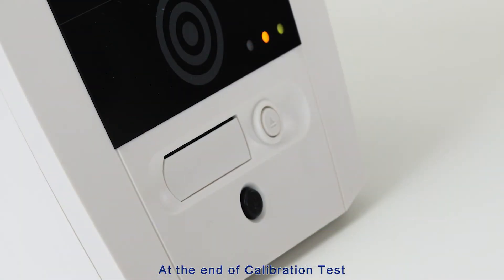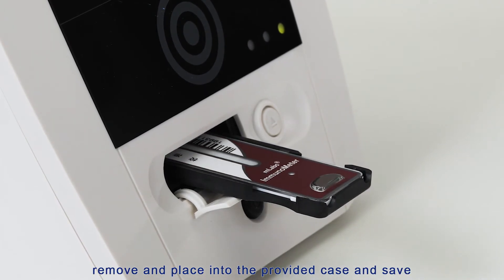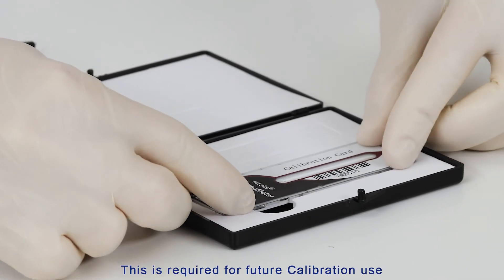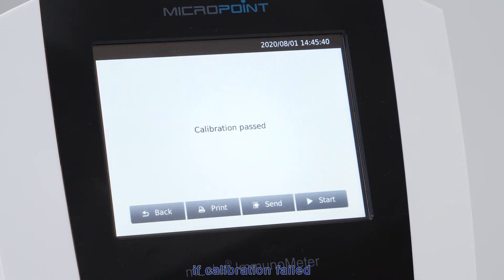At the end of the calibration test, the calibration cartridge is ejected. Remove it and place it into the provided case and save it — do not discard, as it is required for future calibration use. Calibration results will either show calibration passed or calibration failed. If calibration fails, retry with correct steps. If it fails again, please contact your MicroPoint distributor for further information.